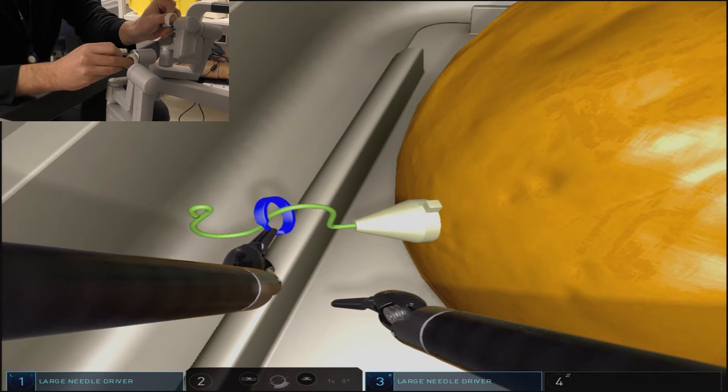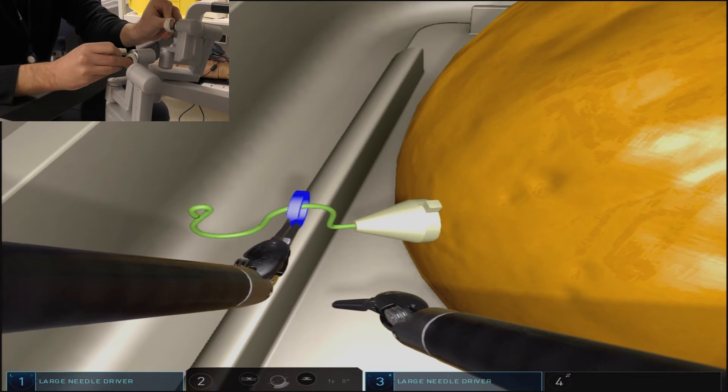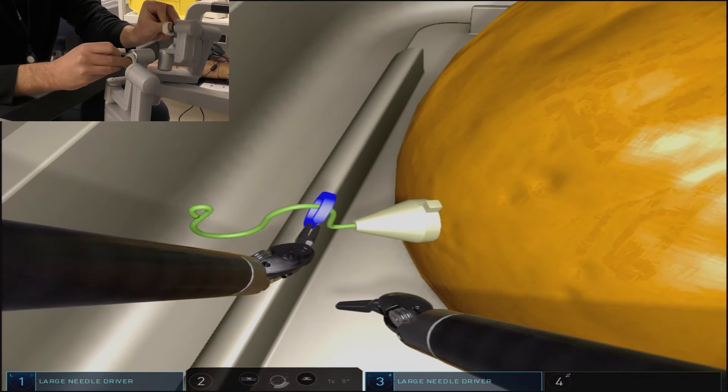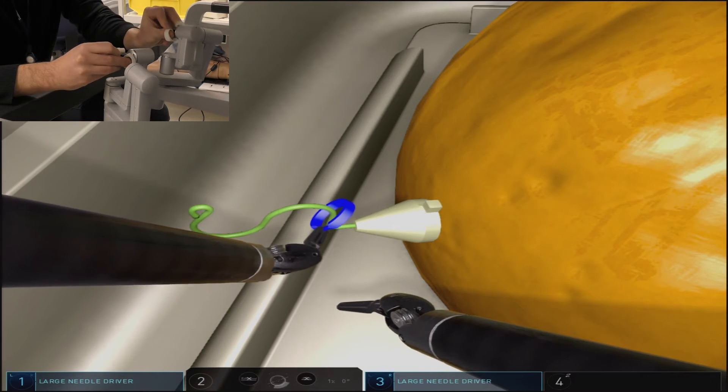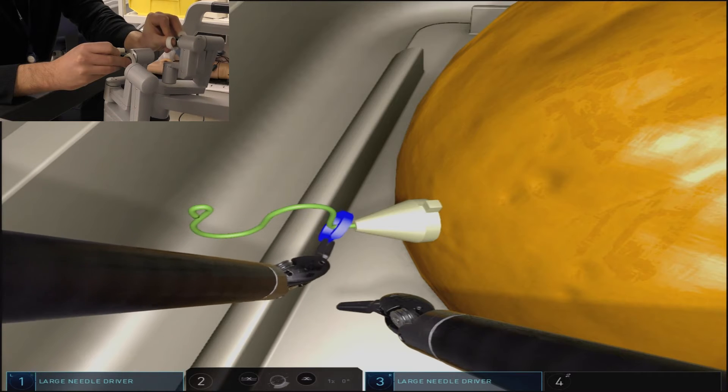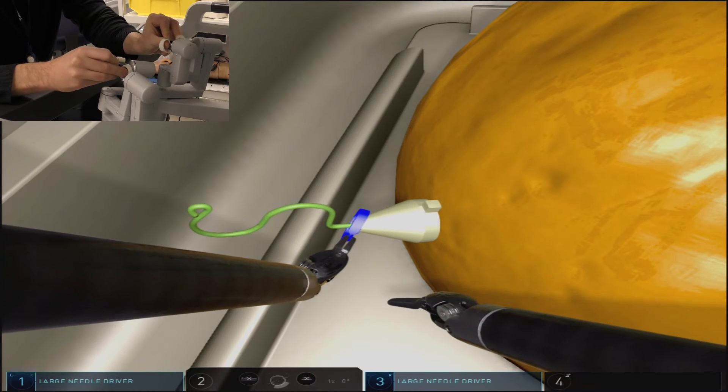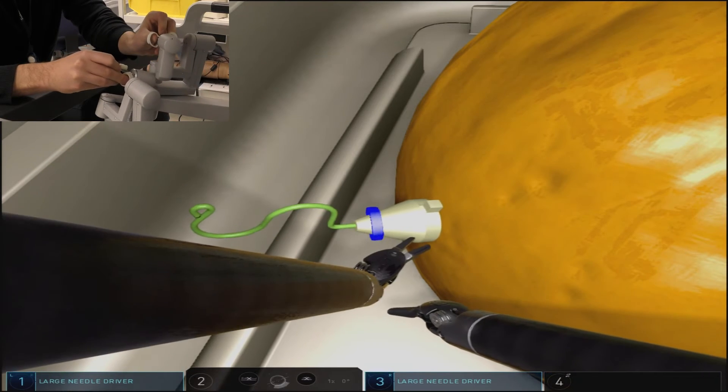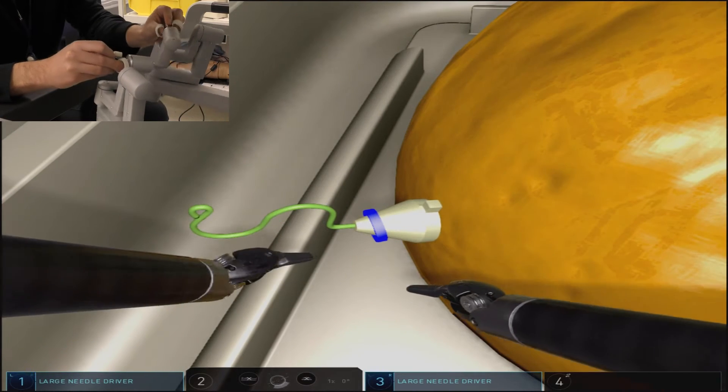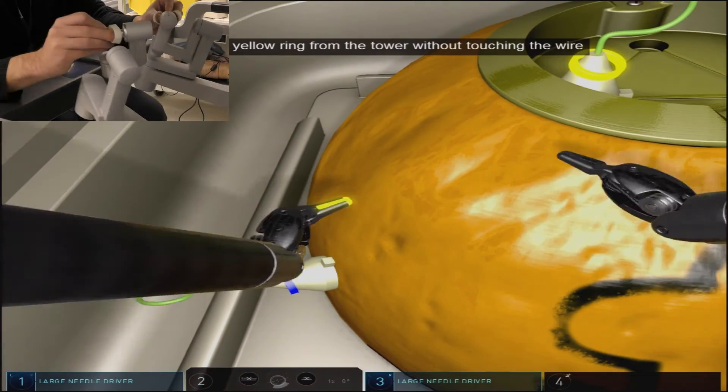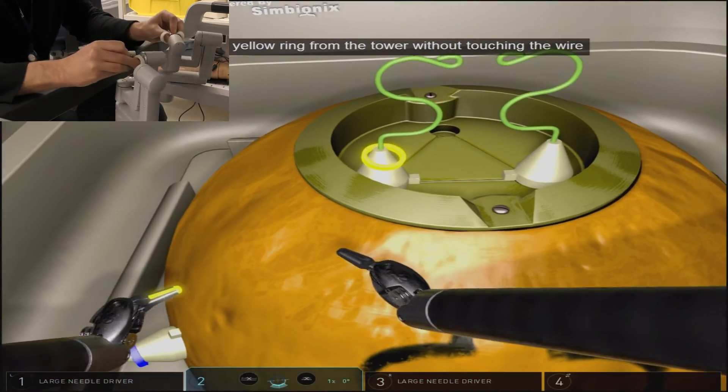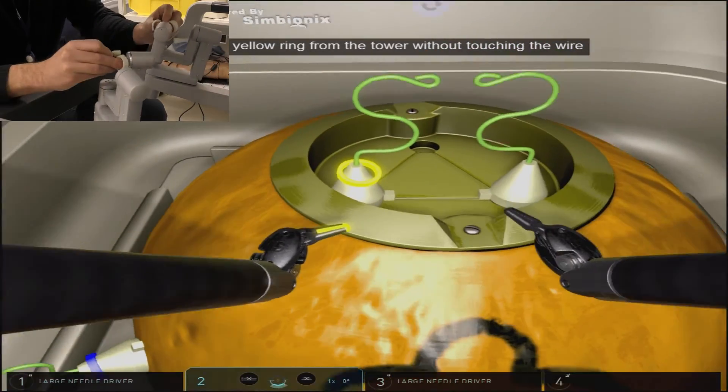When we remove the ring from the top of the dome on the first part of the exercise, we held it in the supinated position. You'll see to place the ring back around this wire structure, we actually approach it in the pronated position.